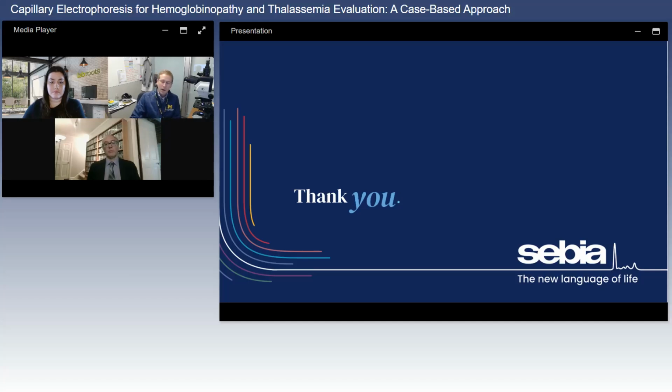well. And then also just percentage-wise, hereditary persistence of fetal hemoglobin typically results in a hemoglobin F in the range of 15 to 30%, depending on the exact underlying cause. However, there are probably rare cases where you can see lower hemoglobin F, but again, clinically that wouldn't really be that important to diagnose typically.